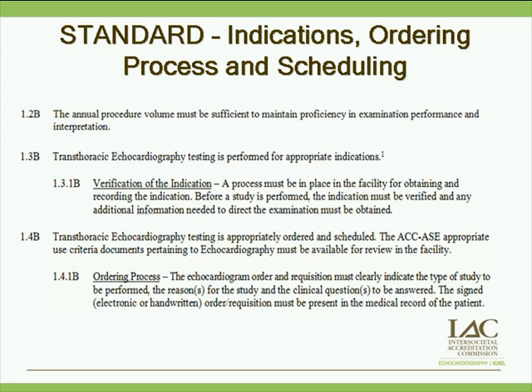Transthoracic echo testing is ordered and appropriately scheduled. And the ACC and ASE appropriate use documents pertaining to echo must be available for review in the facility. Do yourself a favor, get very familiar with the appropriate use guidelines. They are available on the ASE website, and there's also a link to that document from our website under, I think, resources. So go ahead, print a copy, post it in the lab, save it to the desktop in the lab, but please have everybody have a look at it, read it, and get familiar with it.